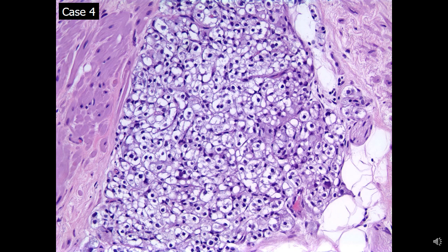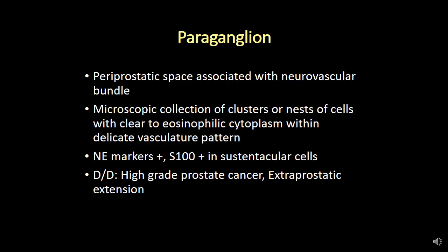The diagnosis for this case is paraganglion. They are typically seen in the periprostatic space associated with neurovascular bundles, so they are more laterally seen in radical prostatectomy specimens. The hallmark feature is a microscopic collection of clusters or nests of cells with clear to eosinophilic cytoplasm within a delicate vascular pattern. This is typically an incidental finding, and the microscopic size is important to distinguish it from a full-blown paraganglioma. In case of doubt, PSA will be negative and neuroendocrine markers are positive. S100 will be positive in a sustentacular cell pattern.